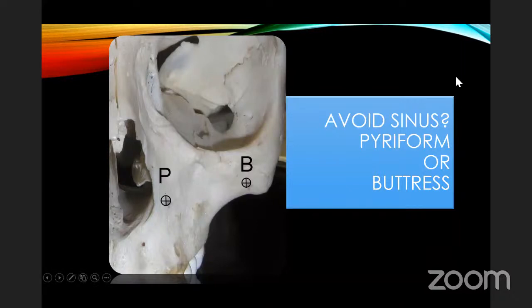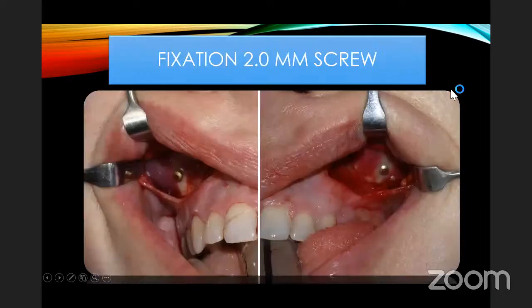I prefer the thicker bone. And I usually put 1 or 2 screws in to hold the implant. Many people place implants and they don't use screws, but I'm a huge proponent of this because I see a lot of patients who present to my office who are treated by another surgeon and their implants have migrated. So I think that placing these micro screws is very important.